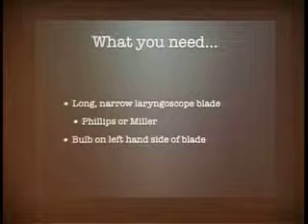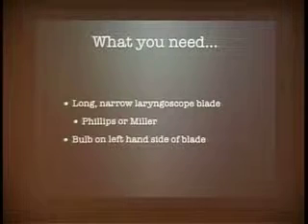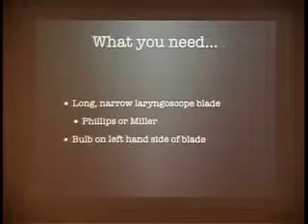a 1 Phillips or a 2 Miller. But there's another characteristic that's important. That'll be the next one. Okay, they're long, skinny. They're open blades. Okay. All Phillips blades have the bulb as you look down on the left-hand side.